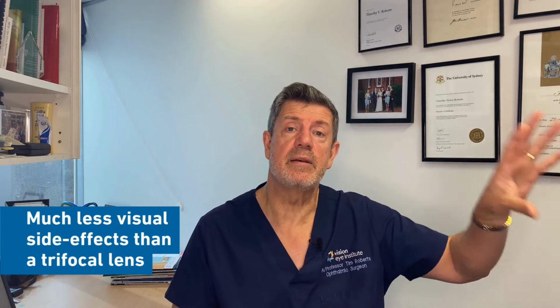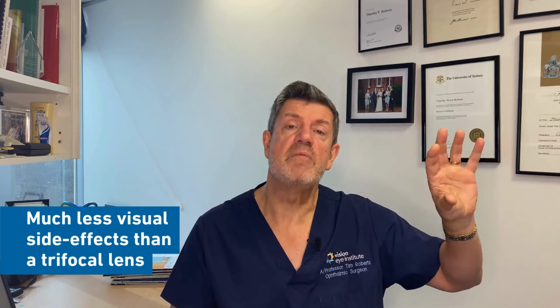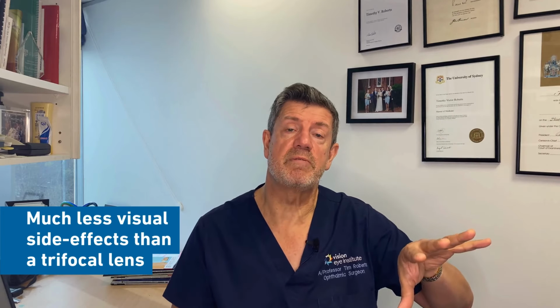I think you need to assume for small print, if you're doing a lot of reading, if it's dim light, you might need some readers, but we're getting very good range of vision, quality of vision, very similar to a monofocal, and similarly the unwanted visual side effects, such as the glare and halo, very much reduced with an extended depth of focus lens. So for many people, we're now finding that the extended depth of focus lenses are giving a very good range of lifestyle vision with high quality sight throughout most of the day.